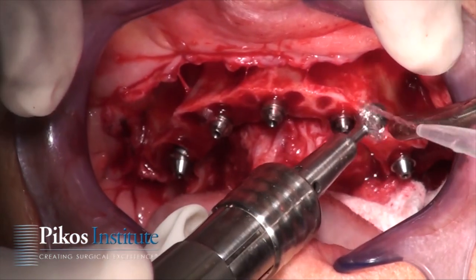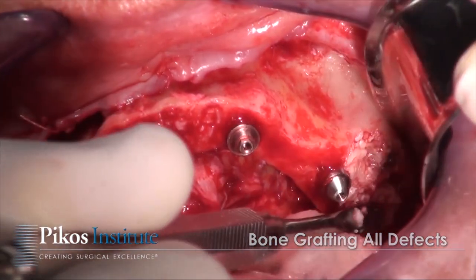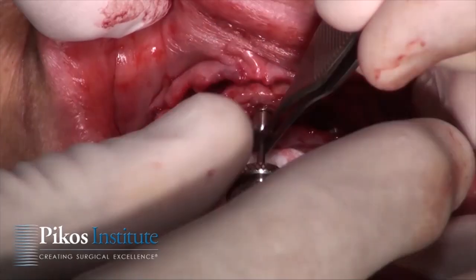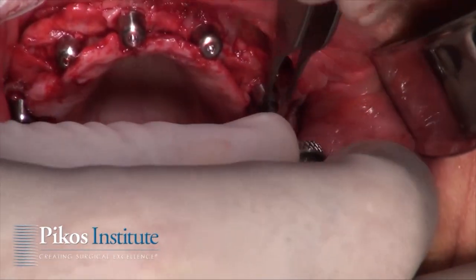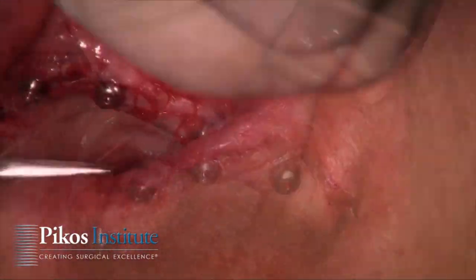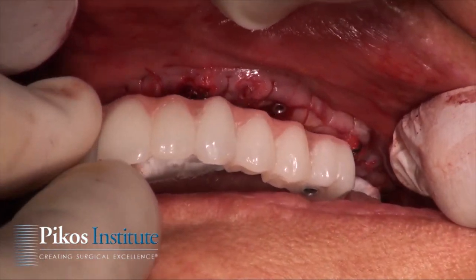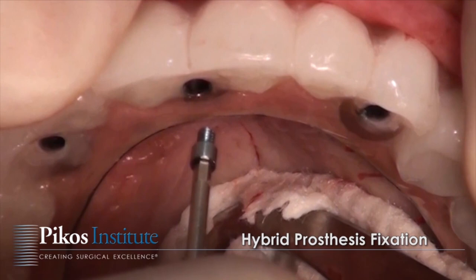So there we have a good bird's eye view of the implants in place with the multi-unit abutments. We're now basically grafting around the defects, into the defects, using our particular autogenous bone that we had. Any allogeneic bone we may need to add to that is fine mineralized allograft and PRF fragments and PRF membranes. There's our primary closure. Healing abutments are now removed, and of course the prosthesis will be placed into position and secured.